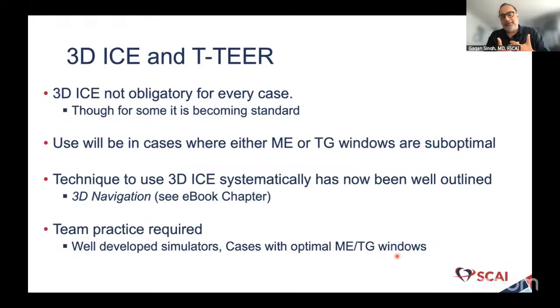Is it obligatory in every case? I think there are some health systems and very experienced operators that have shifted towards that, and that's fine for your health system if you can absorb the added cost. There currently is not reimbursement for 3D ICE, but there are efforts underway to see if that can happen. I think for most centers, its use is in cases where some of the windows are suboptimal.